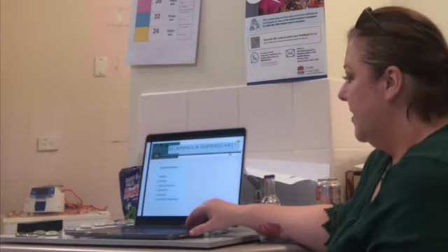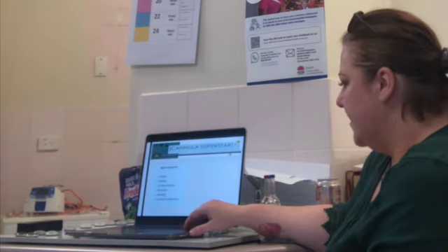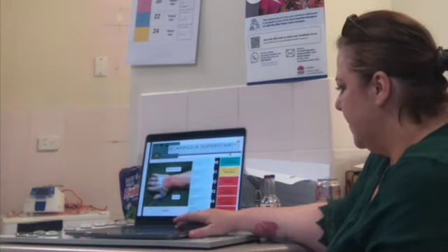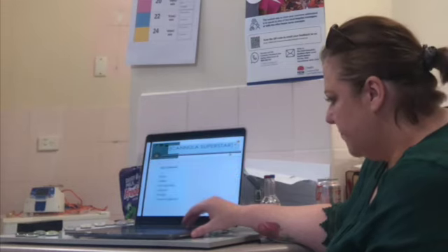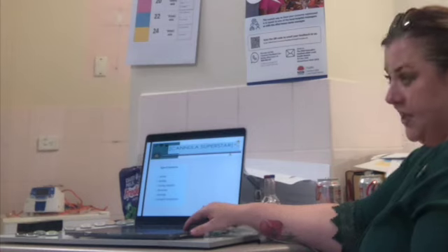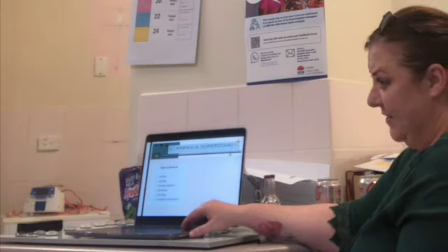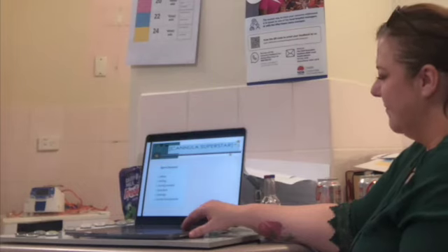So any 2 symptoms, so possible signs and symptoms of phlebitis: redness, swelling, burning sensation, discomfort, discharge, increase in temperature. We've got all those things. That's pretty scary. You reckon it could have been 3? It could have been, because we felt it, it was definitely fresh.